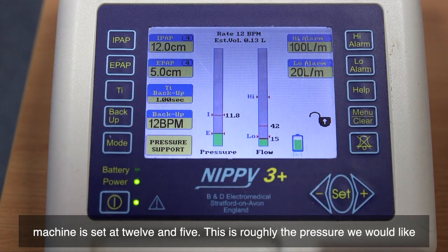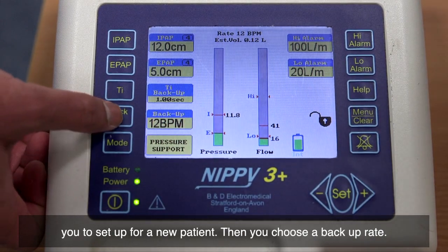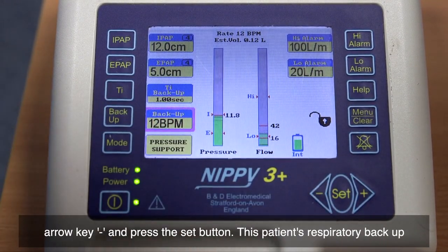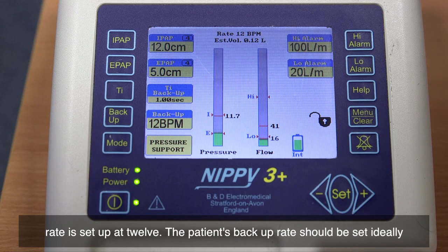This current machine is set at 12 and 5. This is roughly the pressure we would like you to set up for a new patient. Then you choose a backup rate — press the backup button, use the arrow keys plus and minus, and press the set button. This patient's backup rate is set at 12.